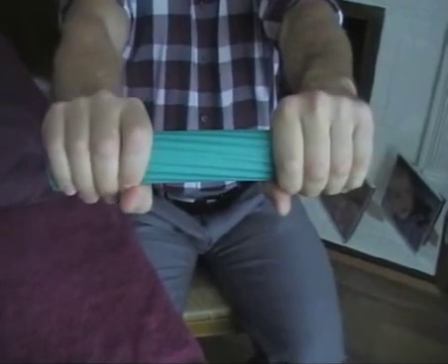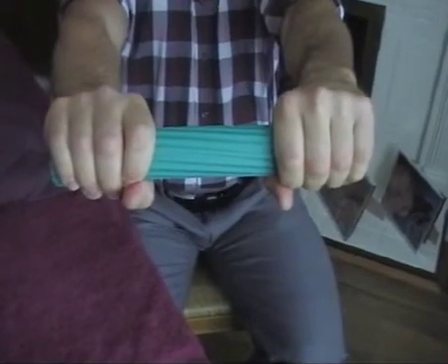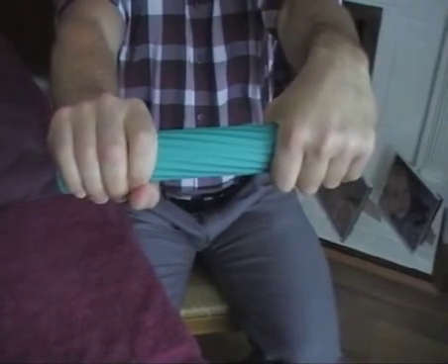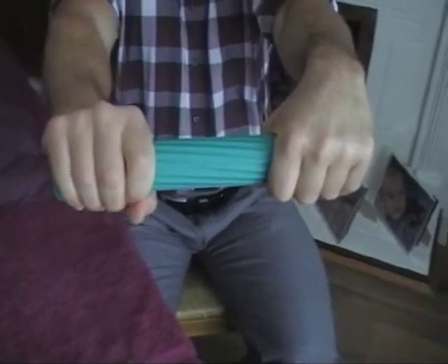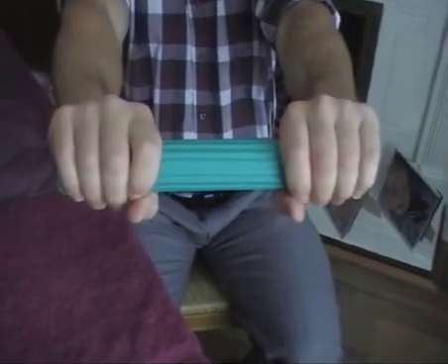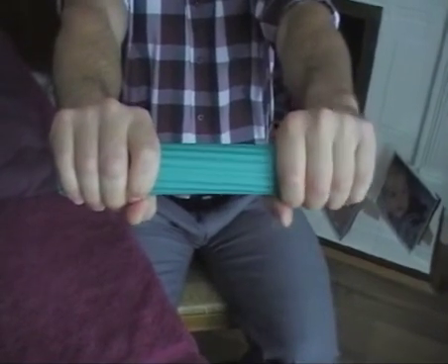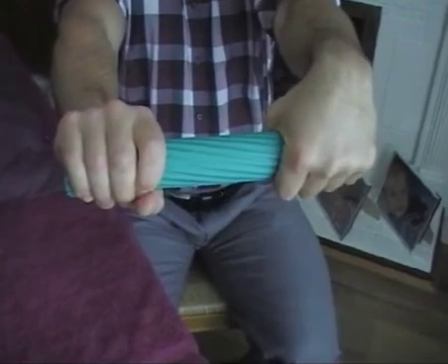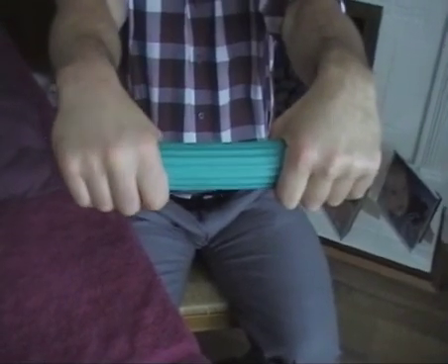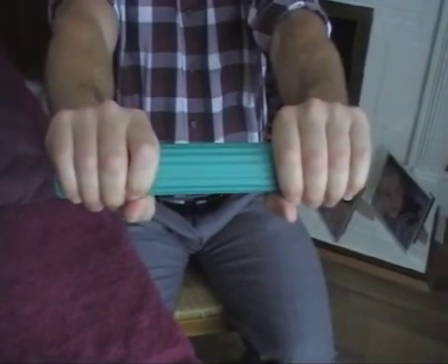Pull your hand back towards you — that's good — and maintain that position. Now I want you to twist your left hand forward on the bar and rotate. Holding that position, slowly release your right hand, and then roll both back together into extension. Then again, load with the left hand by twisting and rotating forward, and then slowly release with the right hand. You're slowly releasing with the resistance, and then bring back into extension. And that's what you keep repeating.